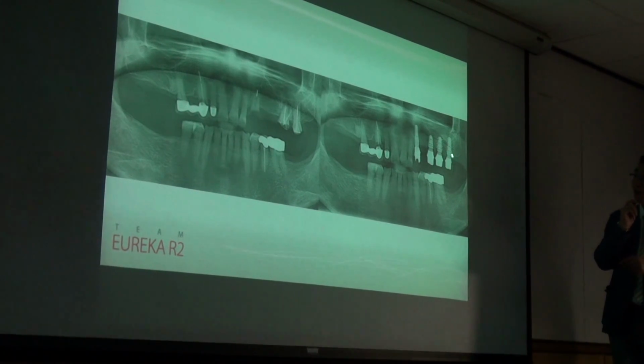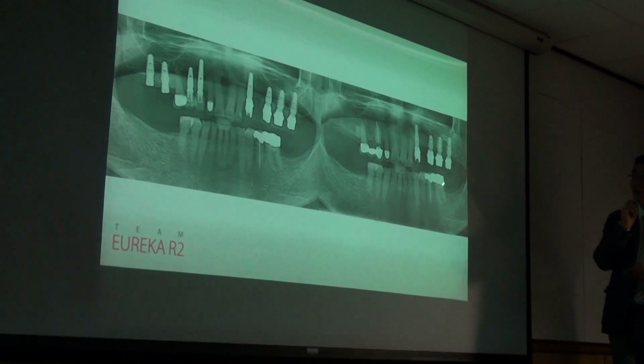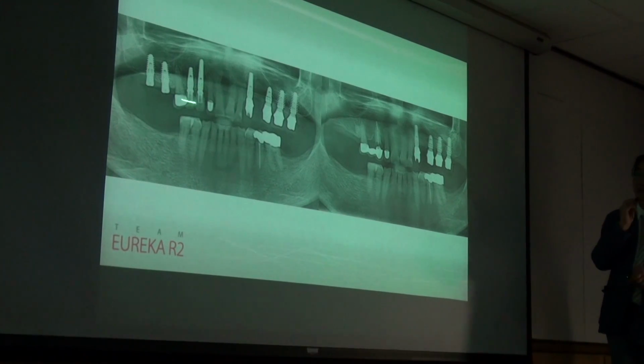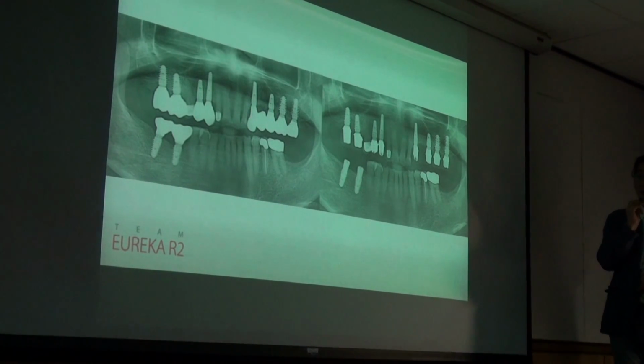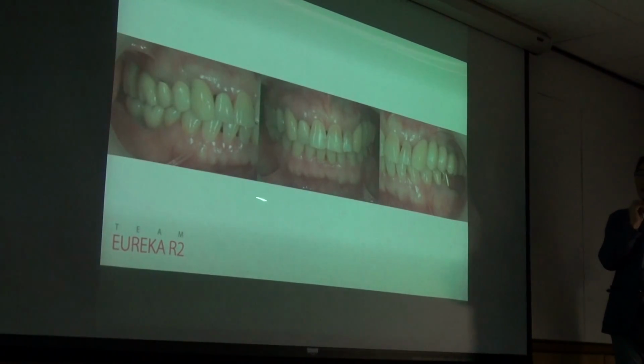And all of the prostheses were made using CAD technologies.